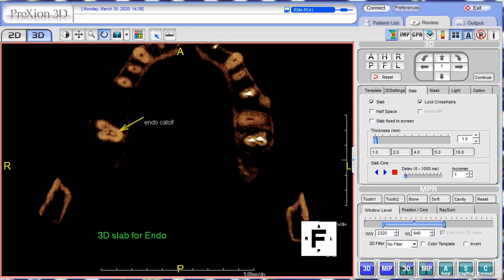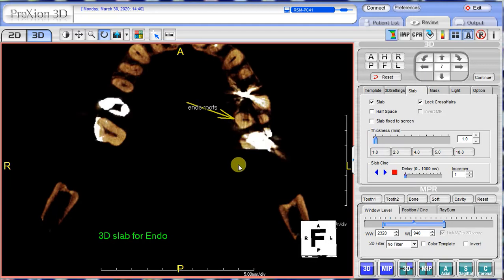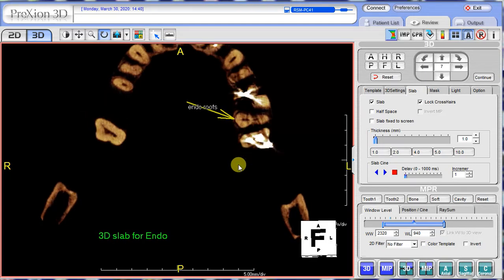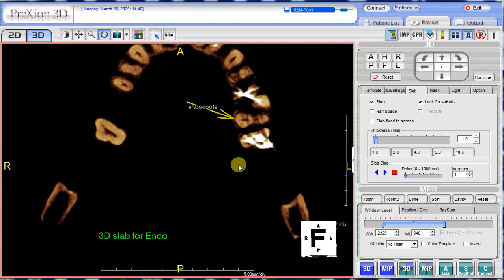Here in this axial 3D slab view you can see an endo calcification. Here on the left side you can see the endo roots splitting. I'm just going to slice this back and forth a little bit so you get appreciation of that — it's very subtle, but nevertheless you can see it very nicely here in the endo slab.